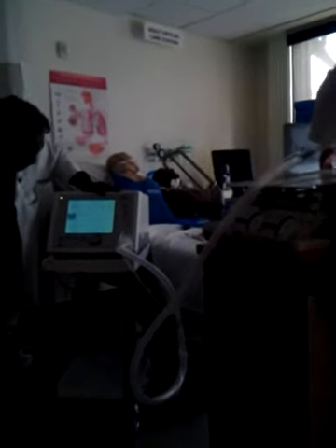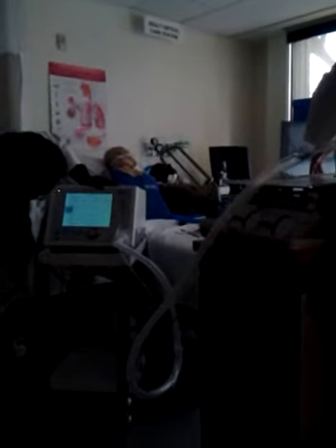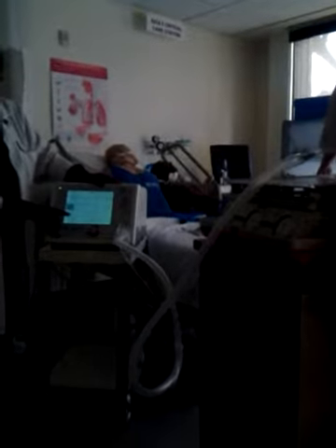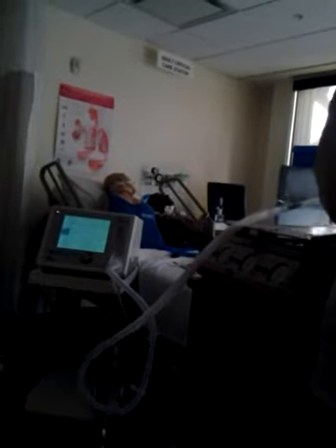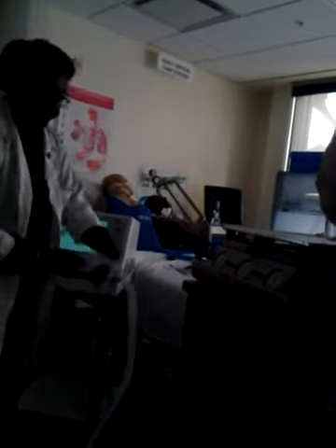With the same type of people, same exact everything, I'm getting about 1,000 milliliters here. Now let's make the lung stiffer. So you would have to decrease then, Mary? You would decrease the IPAP? I'm just showing her right now what happens if the compliance of the lung changes. To increase the tidal volume, you would need a higher pressure. How would you know what the initial settings for IPAP are? They give it to you, the doctor.